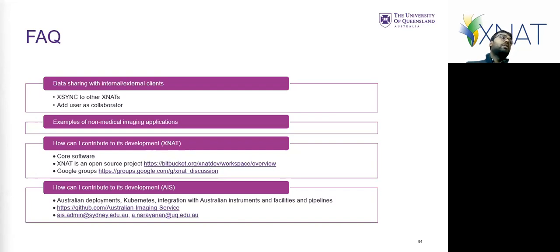They're pretty active on the Google groups. So that's the best place, I think, if you want to get in touch with them, to talk to them. So the XNAT discussions Google groups.